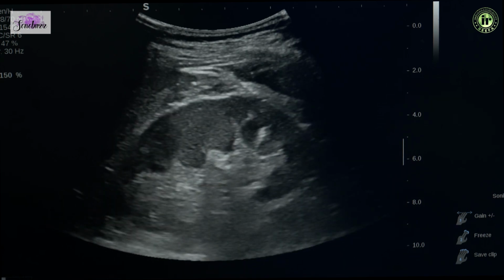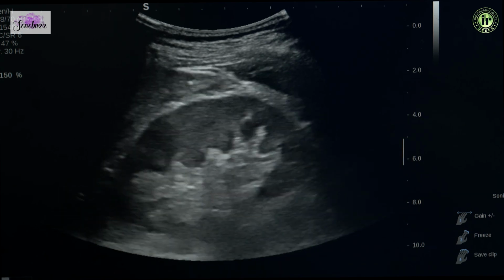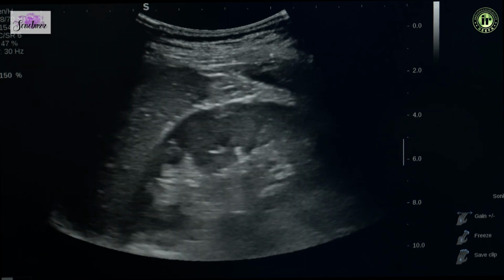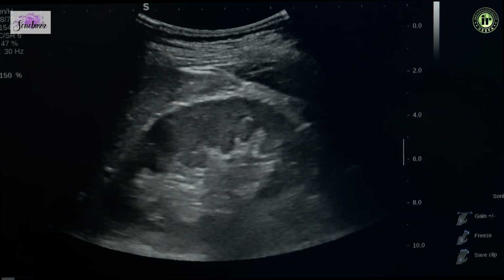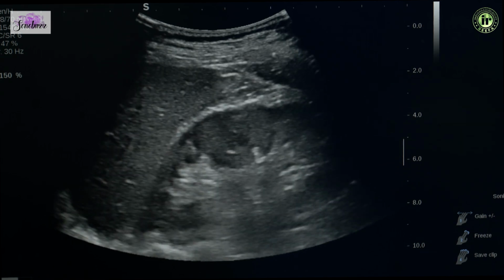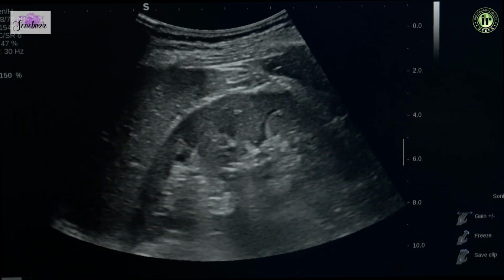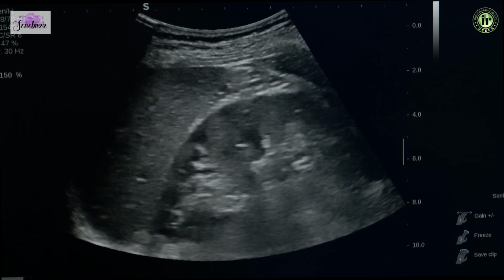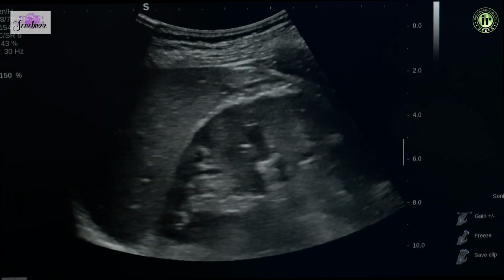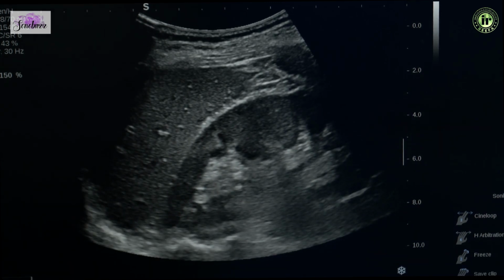For example, over here we have the Supersonic Mach 30 machine, where we are able to get some quantification of a fatty liver. So beginning with what we have is what is called the hepatorenal index. For that, what we do is we take the image of the liver and the kidney in the same section. We go to our auto, where we are optimizing the B mode, and we take an image.